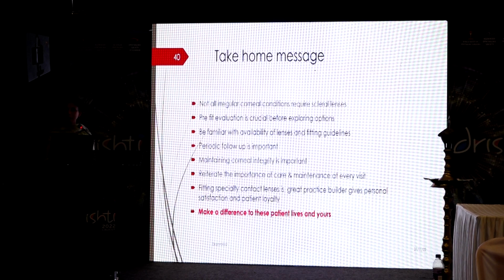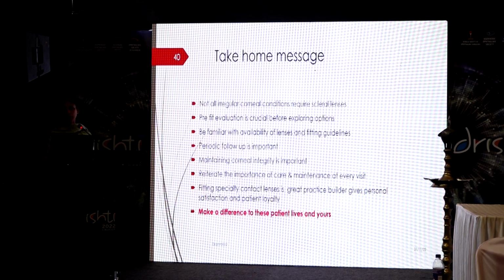Be familiar with the availability of lenses and fitting guidelines. Periodic follow-up is very important. Maintaining corneal integrity is important. Reiterate the importance of care and maintenance during every follow-up visit. Fitting specialty contact lenses is a great practice builder and gives personal satisfaction and patient loyalty. So make a difference to these patients' lives as well as yours.